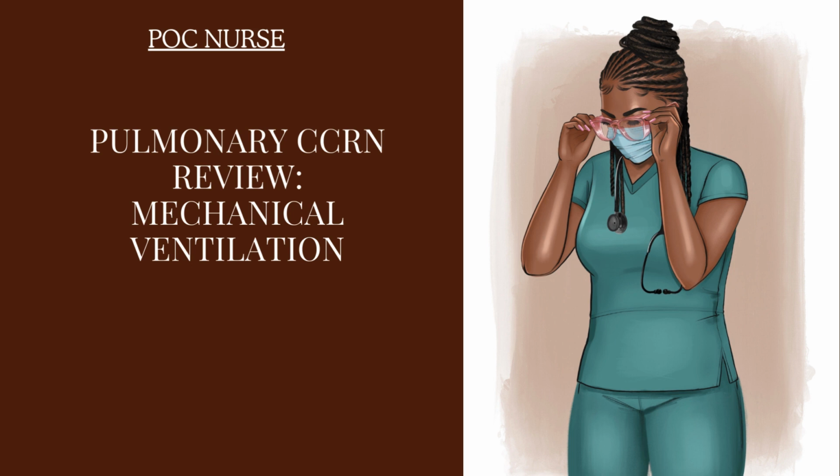So let's do a quick recap of the ventilator settings. We set the respiratory rate or breath rate, tidal volume, FiO2, and PEEP on the ventilator once the patient is placed on the ventilator. Now, depending on why the patient is being mechanically ventilated in the first place, the respiratory rate is usually manipulated as a result of what the patient's PaCO2 is. So if the patient's PaCO2 is high or if it's low, then we manipulate the patient's respiratory rate.